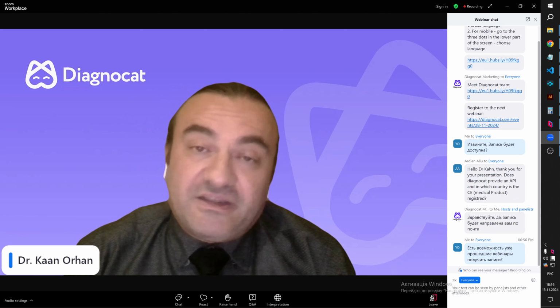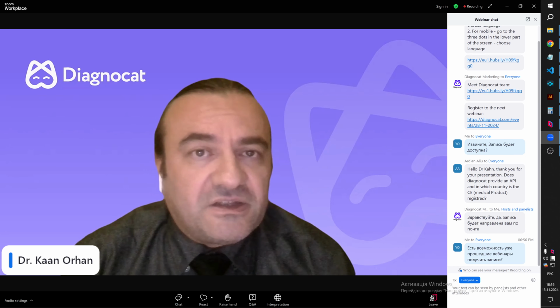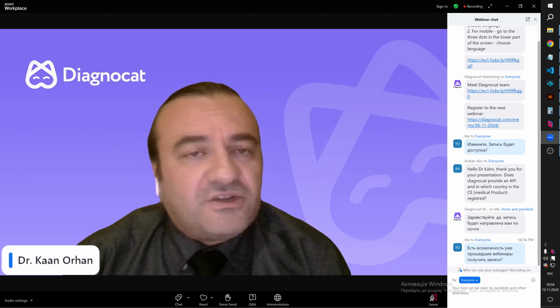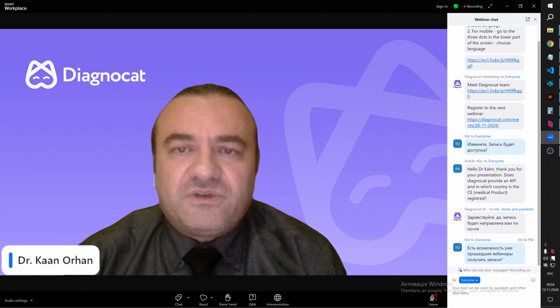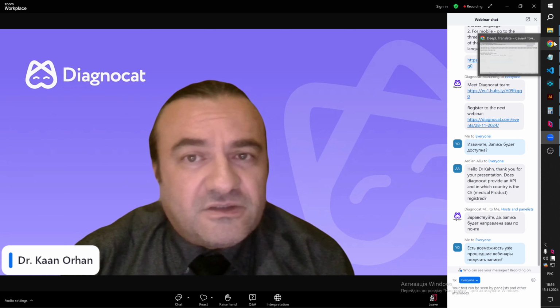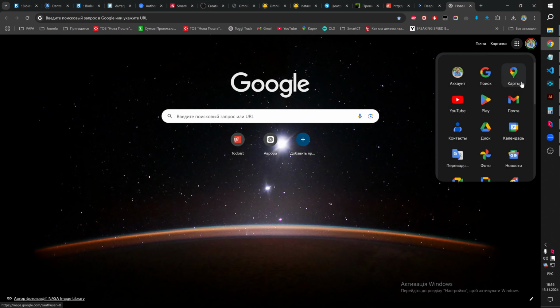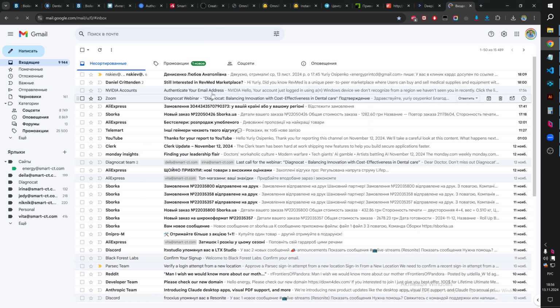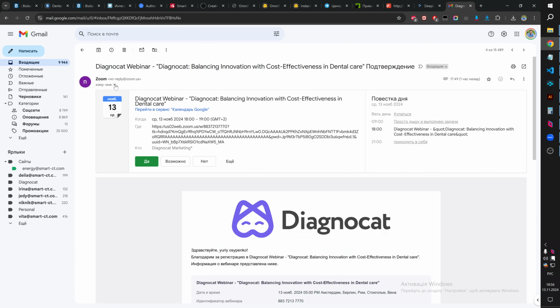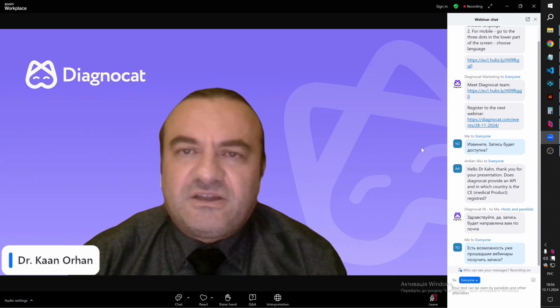As far as I know, and I'm not an engineer, we are using different kinds of networks, starting from the basic U-Net. We are using nnU-Net version 2, and of course a fusion combination of these types of models. This is very technical, but all I can say is that we are using different networks for different kinds of modeling. If you'd like more information, send us an email so we can contact our engineers to tell you more about the networks that we are using.